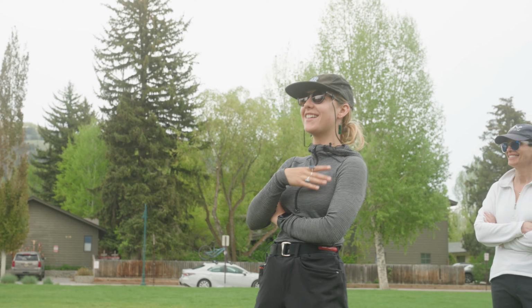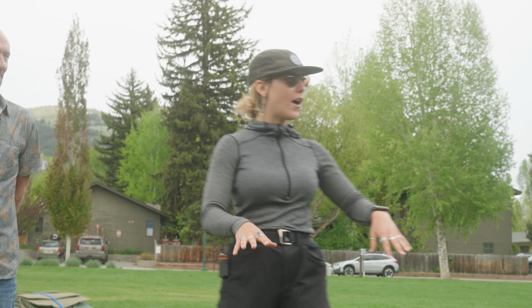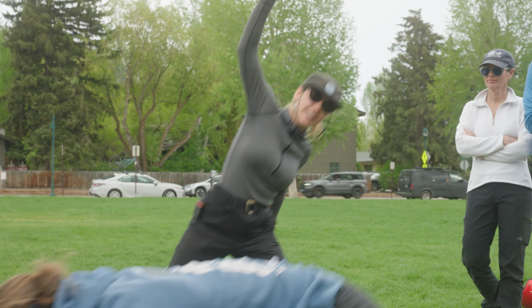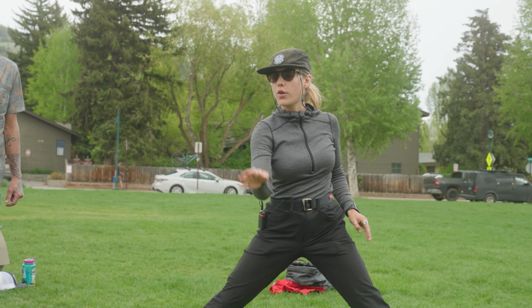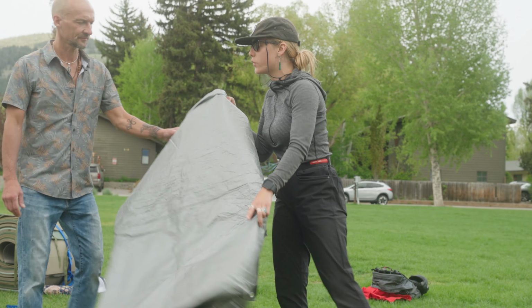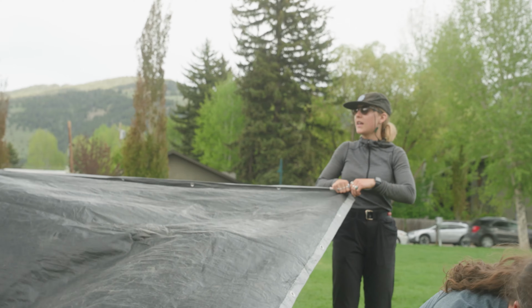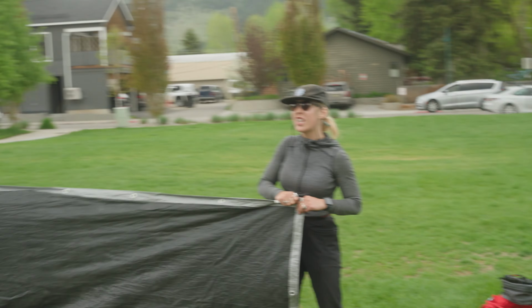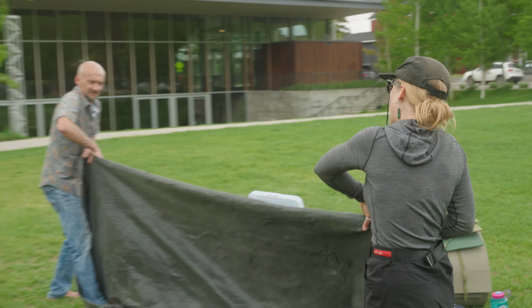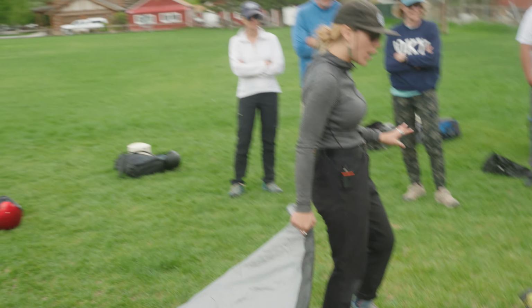Yeah, tarp, exactly. You guys are so wise. Awesome. So if I could have a patient come on down, go face down, full crime scene, all kinds of crumpled. Okay, now I'm gonna have someone come on in and decrumple my patient while me and Jake are gonna get this ready. Okay, so what we're doing here in the background, as you can see, is that we're going to pull this taut and then start rolling the tarp in towards the center, okay?